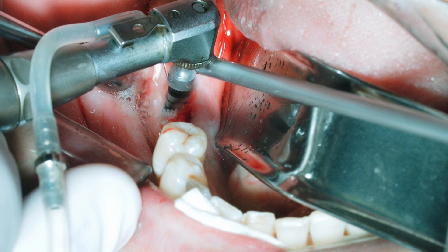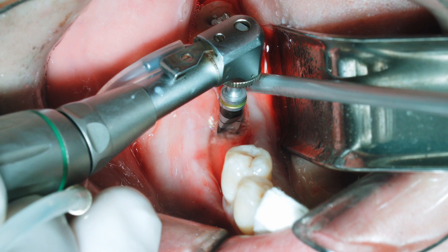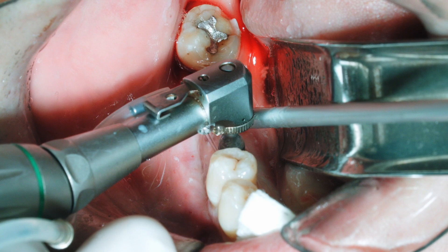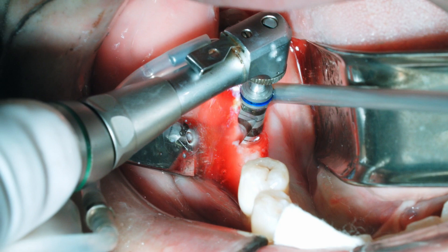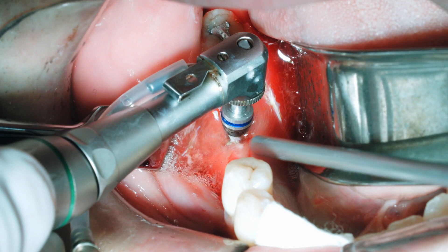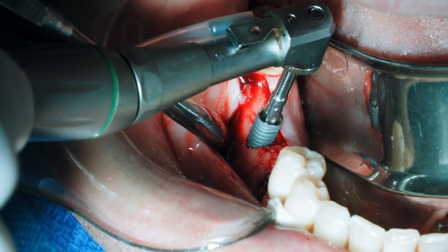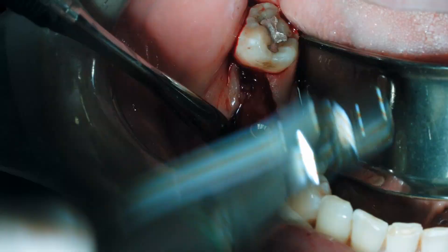This is going to be sequenced on the right side in a step-by-step process, going to the number three multi-drill and then to the number four multi-drill. It's important to identify the level you want for the top of the fixture where there's an uneven bone level — going a little deeper on the lingual side so the implant is well countersunk on the buccal side. The top of the thick black line is at 10 millimeters, equivalent to the platform level on the buccal bone so it's all within the osseous structure. We can see the implant being placed, and you'll notice that blood is attracted to the sandblasted acid-etched implant surface, so we'll get a nice fibrin clot around the implant.